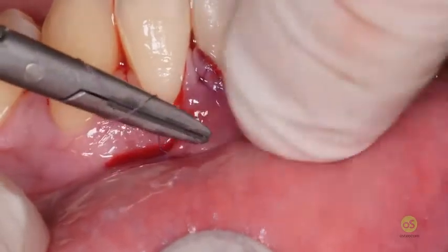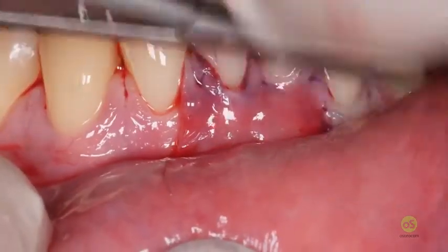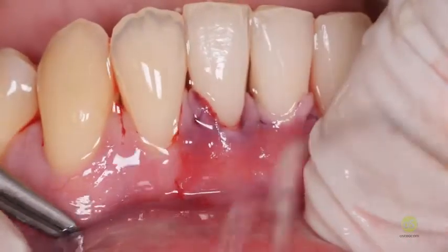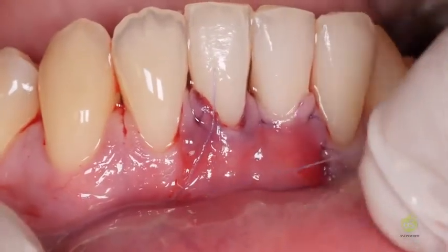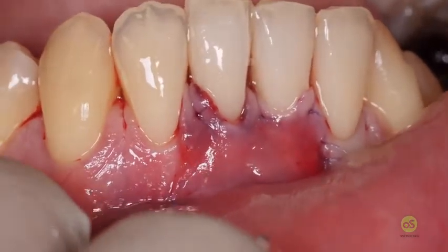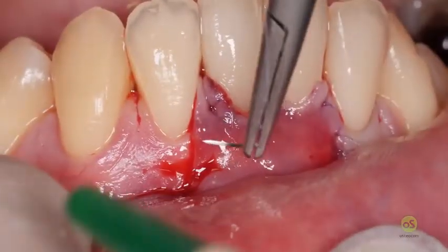Theoretically, this shouldn't be pulled at all, because with this suture, you see, when I close this, I fix the surgical knot in position. Also, the distal aspect of the vestibulum depth is completely restored. Now we complete the closure like we did on the other side along the vertical releasing incision, and theoretically you should remove the blood in excess. You should not pull more than this of the vertical releasing incision.